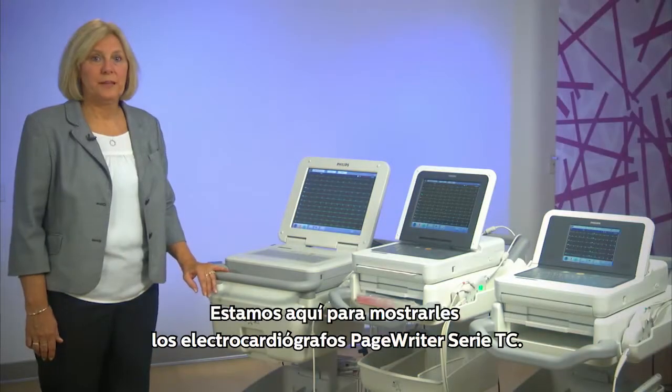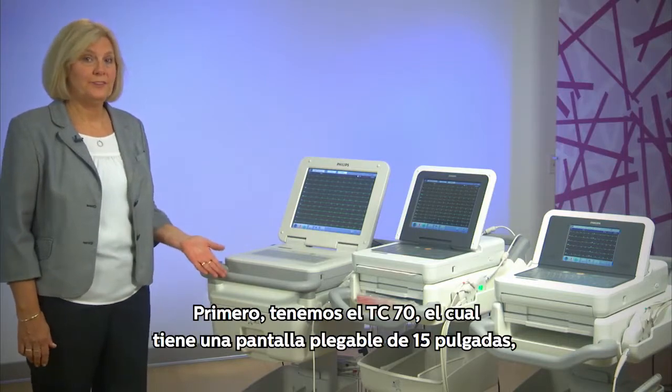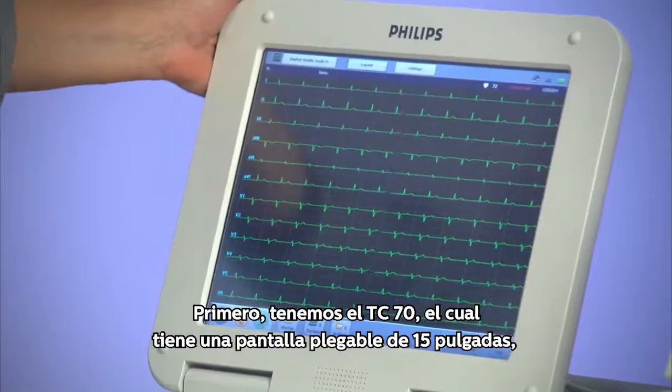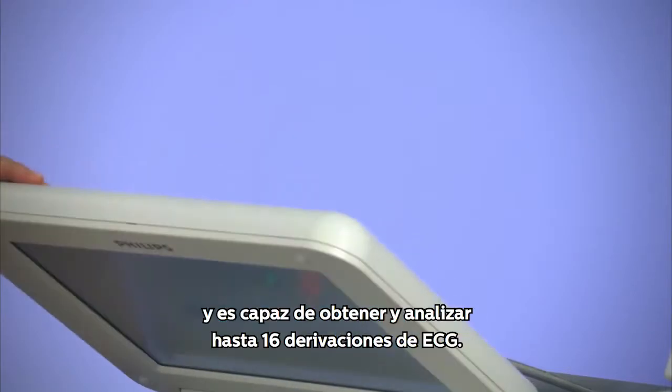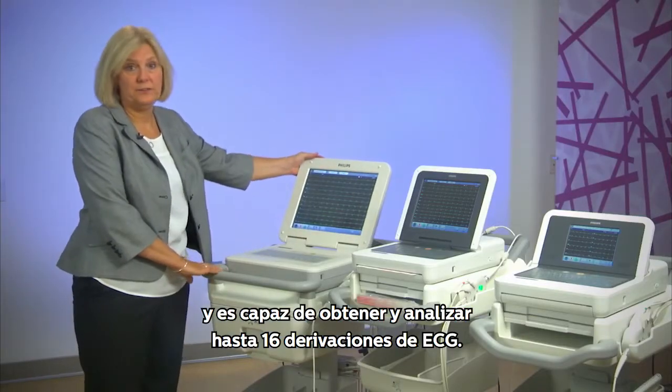We're here to showcase the PageWriter TC Series Cardiographs. First, we have the TC-70, which has a 15-inch foldable screen and is able to acquire and analyze up to 16 leads of ECG.